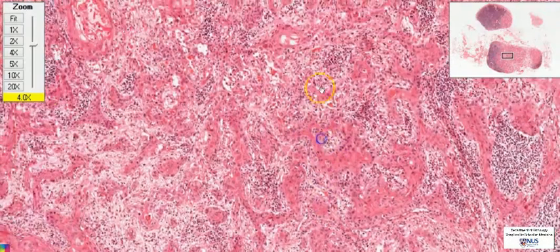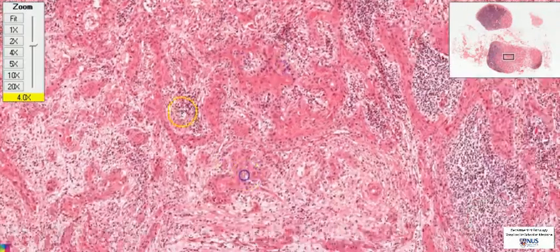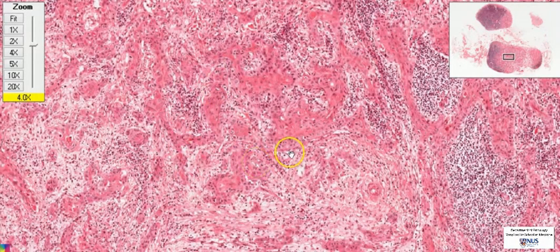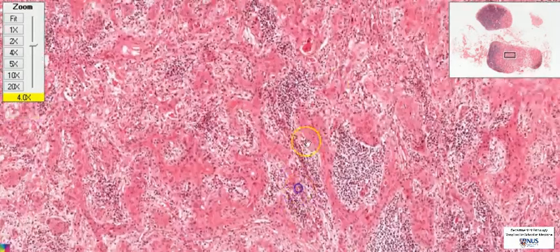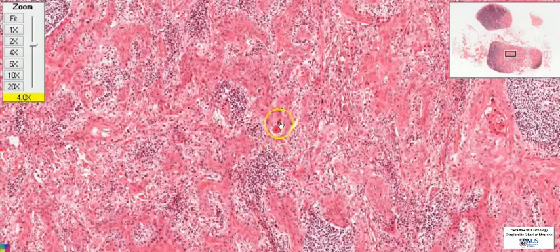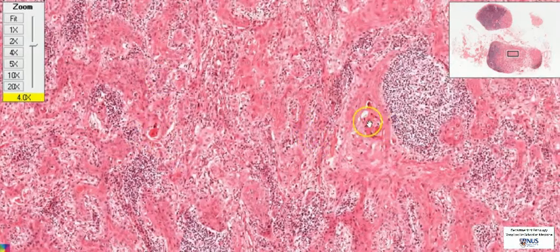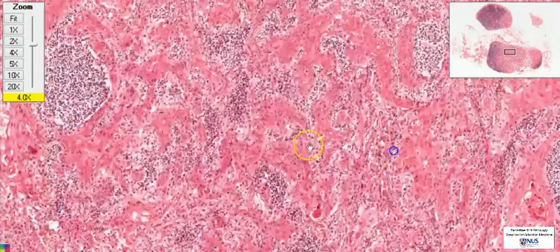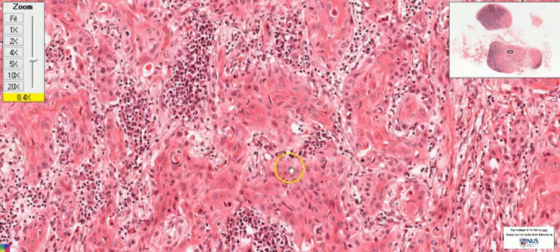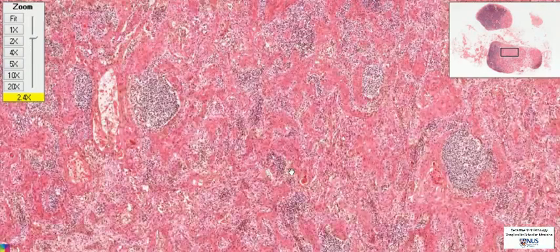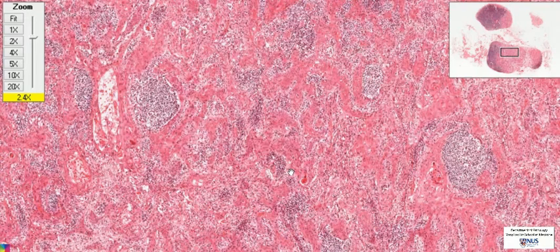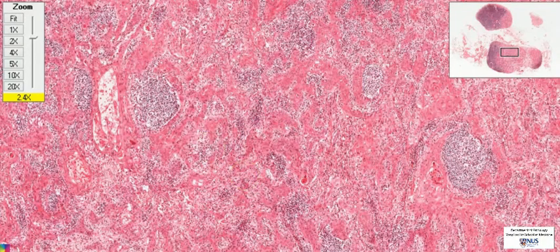So just to summarize, we have branching trabeculae or sheets of cells which do not form any glands. There are occasional keratin pearls, and on high power, the cells display cytologic features of malignancy. Therefore, this is metastatic carcinoma in a lymph node, and because of the presence of keratin pearls, this is metastatic squamous cell carcinoma.